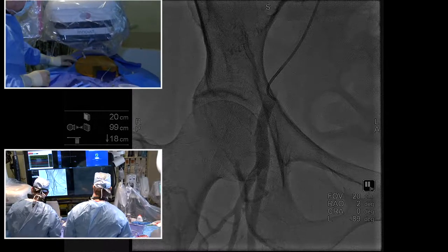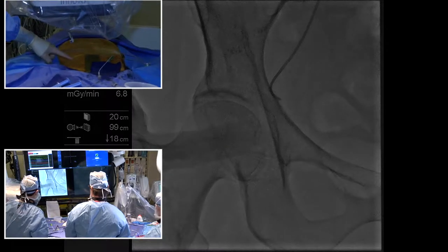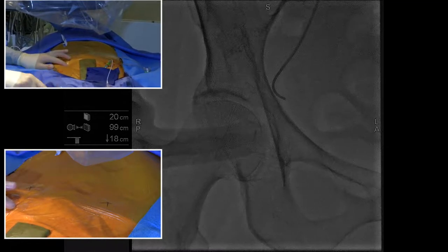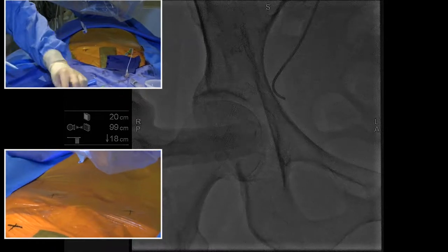So what we want to do is access the common femoral, and we want to access that over the bony landmark. So I'm going to put my finger here. This is the exact spot I want to go in. So what I'm going to do is move my table, and I'm going to mark this area on the skin with a felt pen, so I kind of know where I'm going. And that's the area I'm going to numb up.